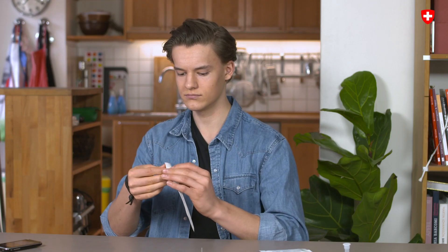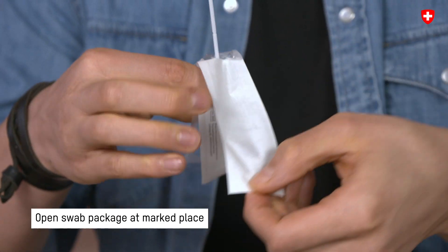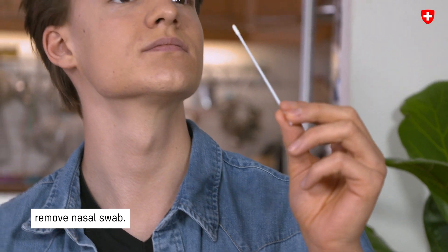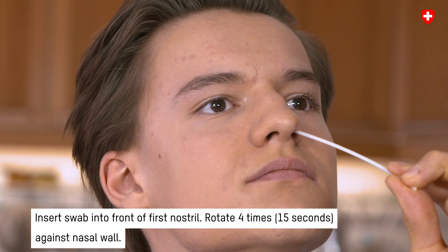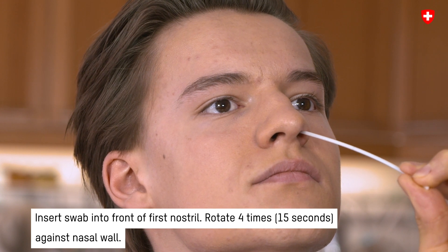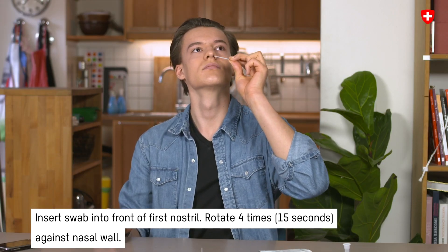Step 3: Collect the sample. Open the swab packaging at the marked place and remove the nasal swab. Tilt the head slightly back. Then insert the absorbent tip of the swab about 2cm deep in the front part of the first nostril and rotate 4 times, i.e. for 15 seconds, against the wall of the nose.